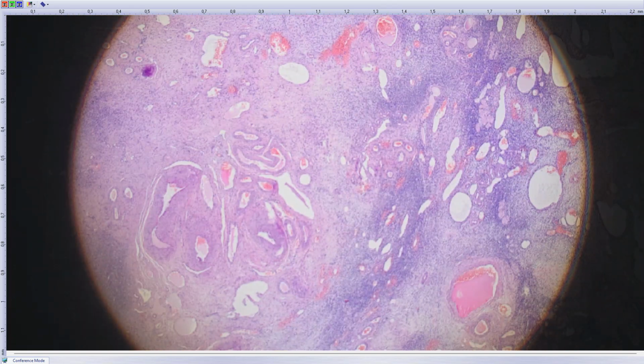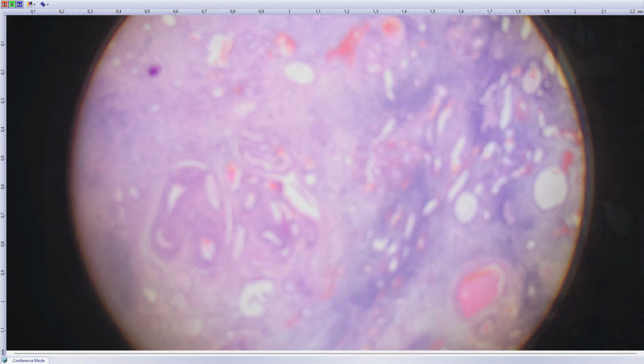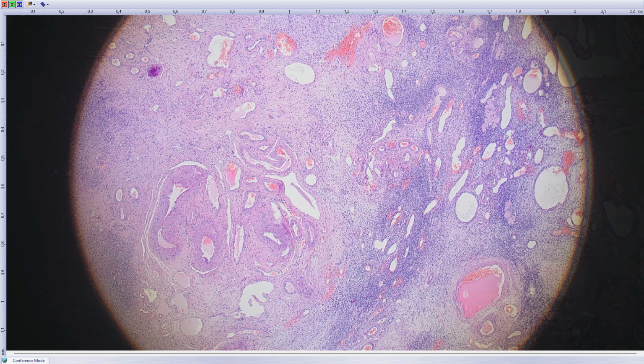The first one is quite a peculiar case, and the patient was a 19-year-old woman who had a tumor of the ovary in 2022, which was diagnosed and correctly diagnosed. We revised that it was a mixed germ cell tumor, composed of embryonal carcinoma, dysgerminoma, teratoma, and yolk-sac tumor. I'm not showing you this biopsy.